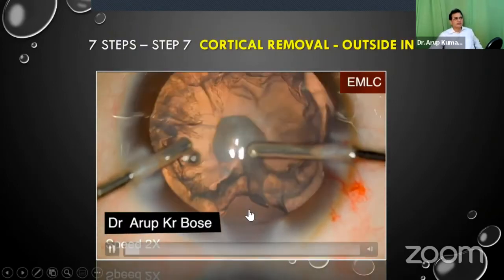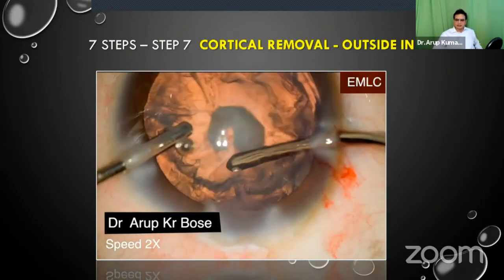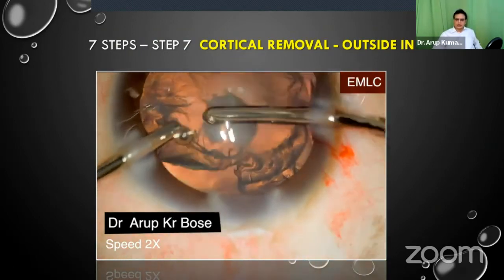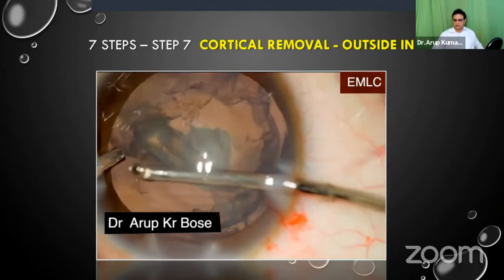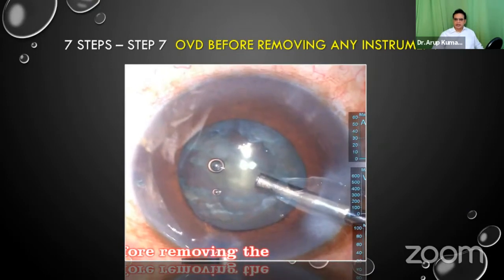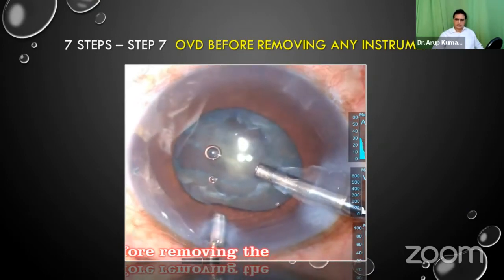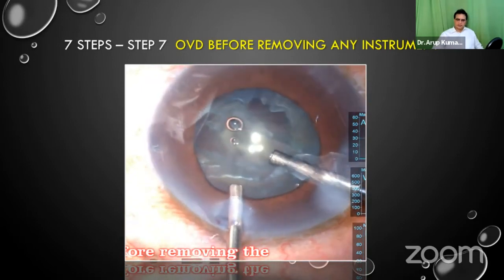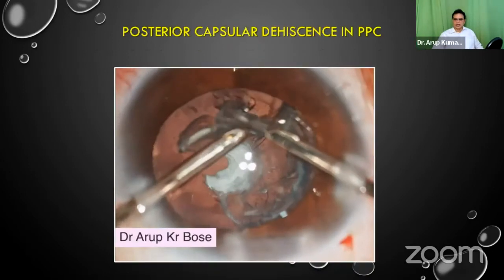Even for cortical removal, you should start from the periphery and then come to the center. It's a rule that you should always do everything outside in, not inside out. And injecting viscoelastic before removal of all the instruments is another very important step, and it is particularly important in myopia as well as in cases of posterior polar cataract.